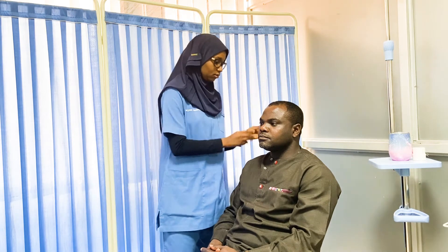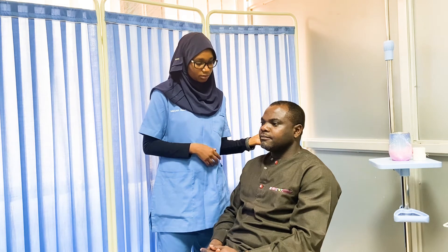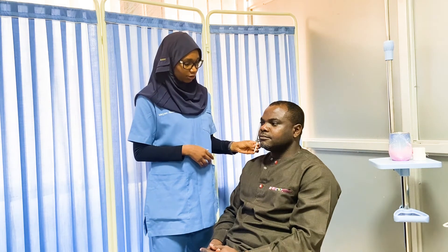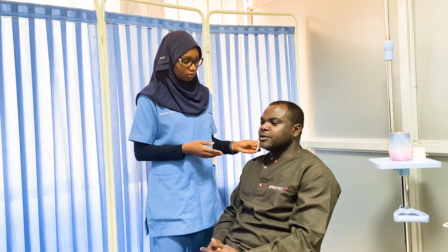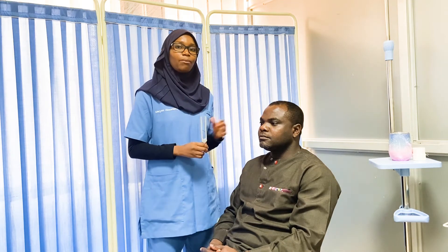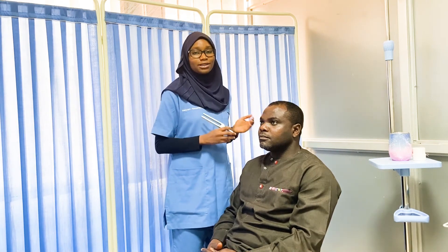We'll look at an abnormal situation now. Can you hear it? Yes. Tell me when it stops. It has stopped. Can you hear it now? No. In this patient, he is not able to hear the tuning fork after we bring it next to the ear, meaning bone conduction in this patient is more than air conduction. In this case, we can say the patient probably has conductive hearing loss. Then we test the other ear to confirm.